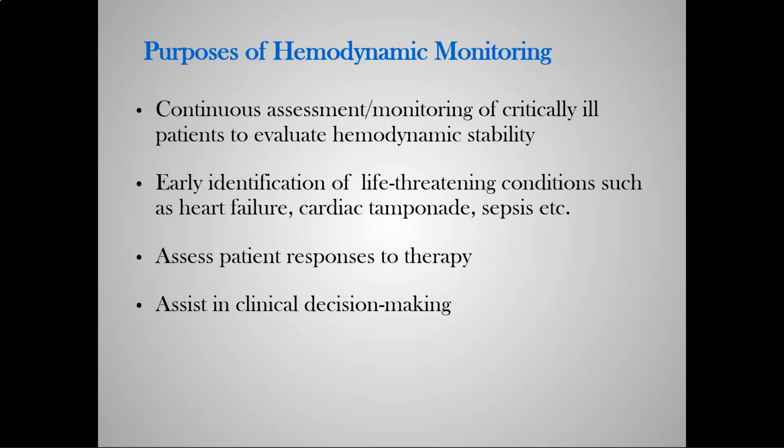Hemodynamic monitoring is incredibly useful because it really allows us to manipulate blood values, volumes, and vasoconstrictive or dilative properties. And that's the only way we would get these numbers and know how to manipulate them is through hemodynamic monitoring, arterial lines, central lines, and in some instances, Swan-Ganz catheters. Okay, so this is continuous monitoring. This isn't I take a blood pressure Q4 hours and I go ahead and document it.